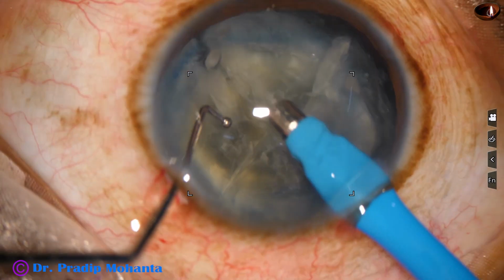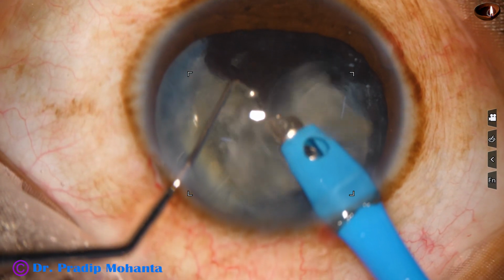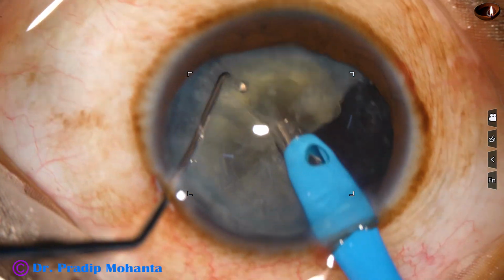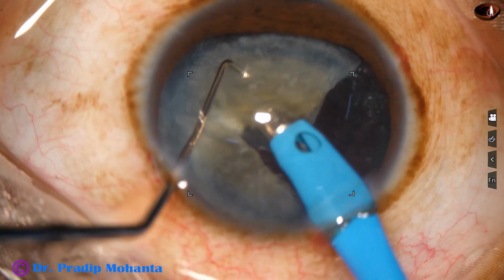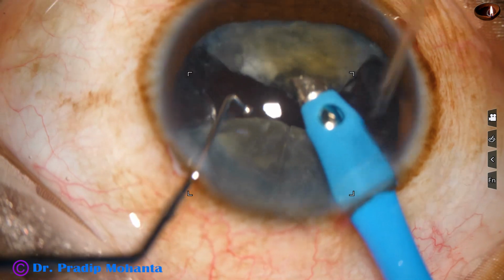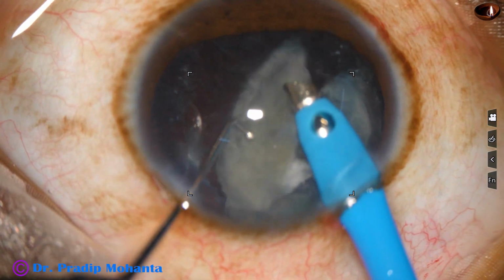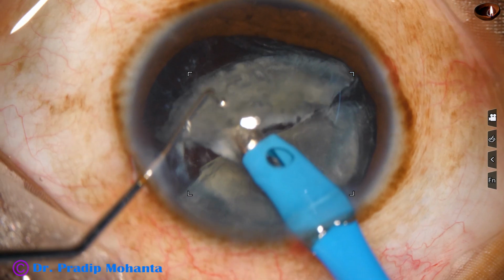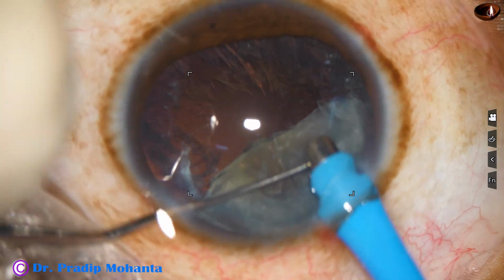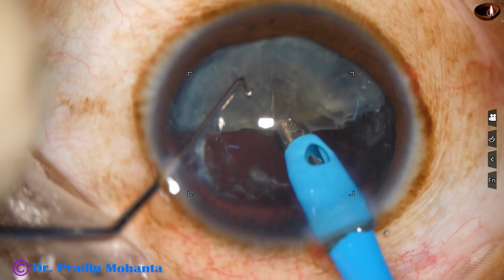And now I use the phaco needle to pick off each fragment and emulsify. Ultrasonic energy used in this case is 60%, set at 60%. The ultrasound is delivered as much as required. It is controlled by foot switch. For cortex, I may be delivering only 10% ultrasonic energy. For nucleus, I may be delivering about 50% ultrasonic energy. It depends on how hard the lens matter is that occludes the phaco tip.